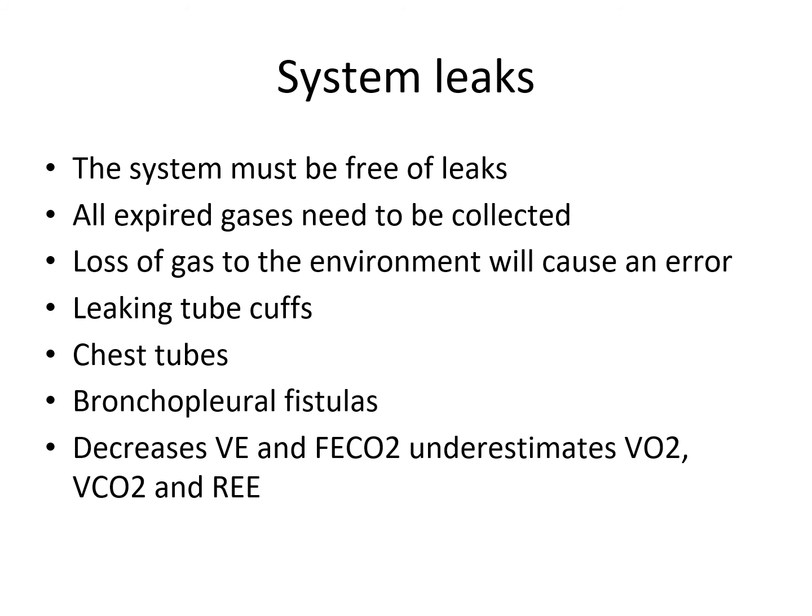Making sure your chest tube doesn't have any leaks, that there are no bronchopleural fistulas. Decreases in minute volume and fractional expired CO2 can underestimate your oxygen consumption, your CO2 production, and your resting energy expenditure.